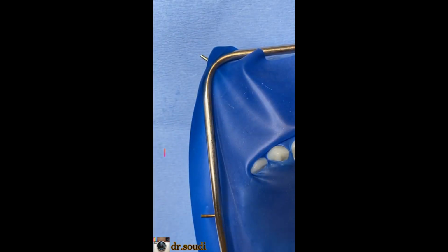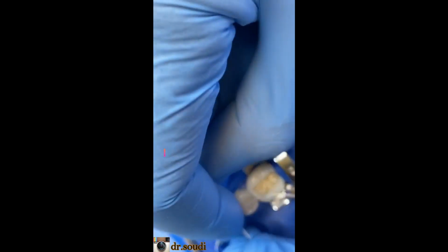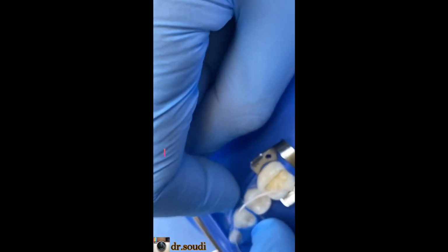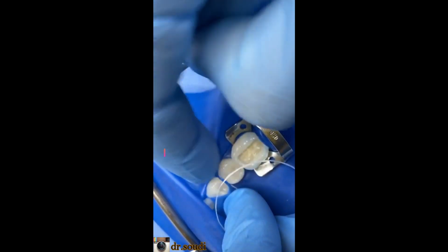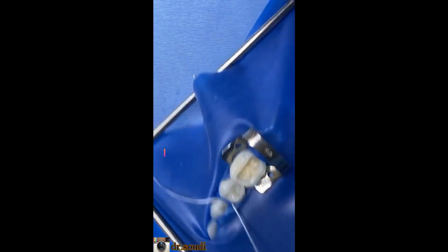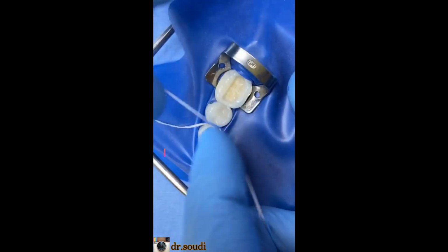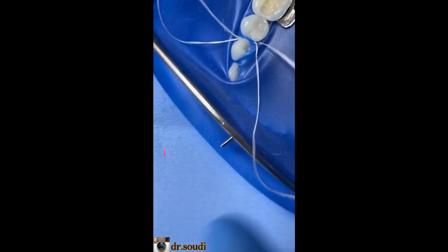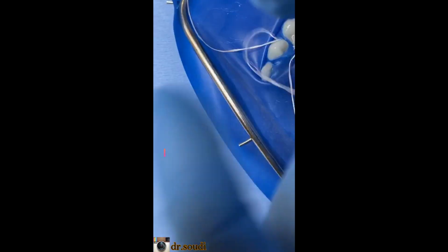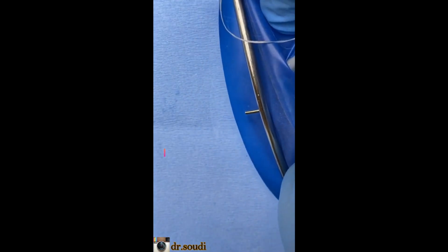Okay, you still need a patient. Sorry, you need an assistant. You press it like this. You can see if you remove the floss like here, you will get a tear here. So I will again bend it like this, another one, and go more, third time.